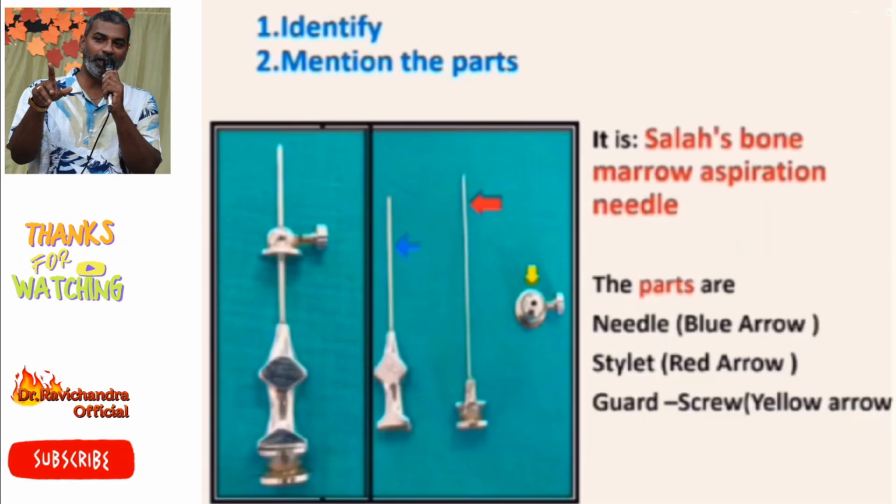Coming to the bone marrow aspiration needle, there are various bone marrow aspiration needles, Klima needle, Salah needle. This is a picture of Salah's needle. It has needle, stylet and guard. The guard with screw is represented by yellow arrow and the stylet with red arrow and needle with blue arrow. The name itself is indicating that it is useful for aspiration of the bone marrow.